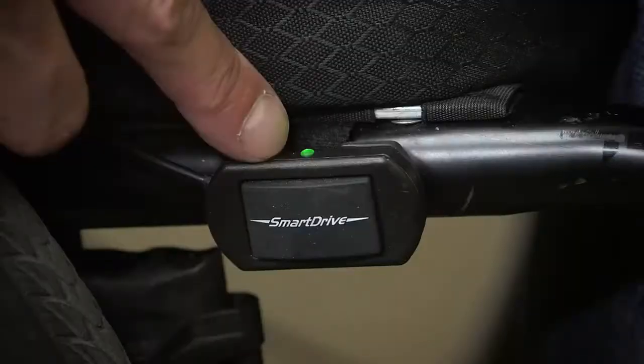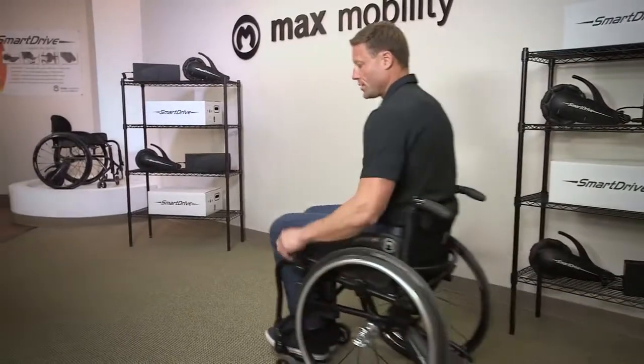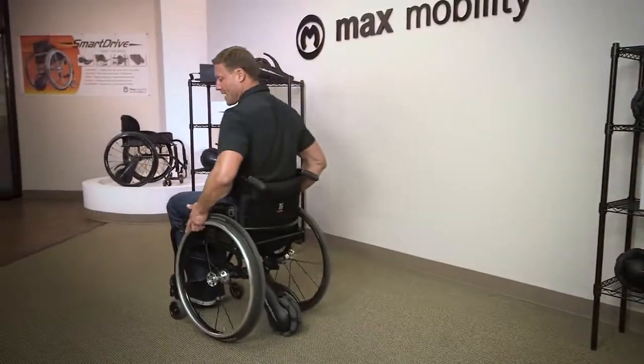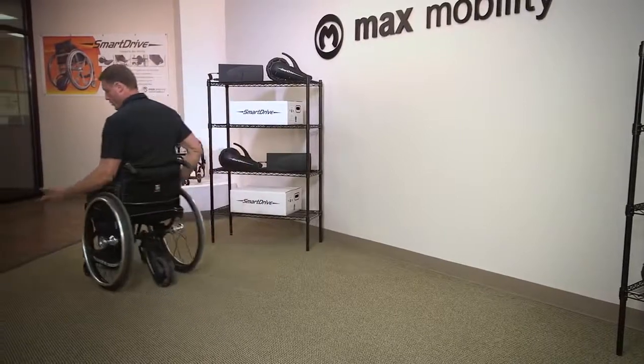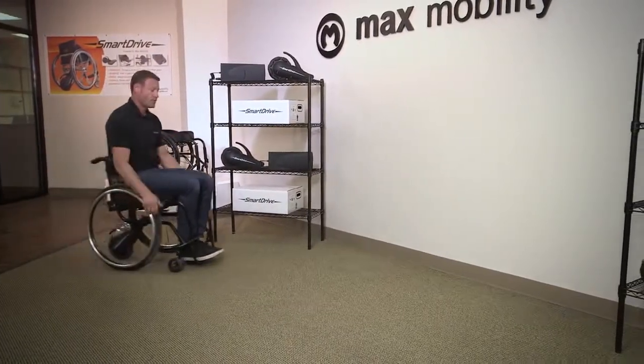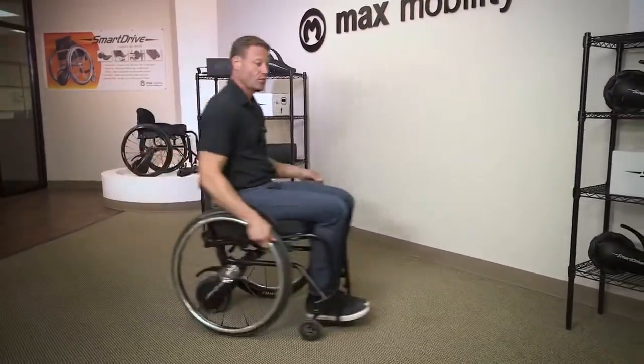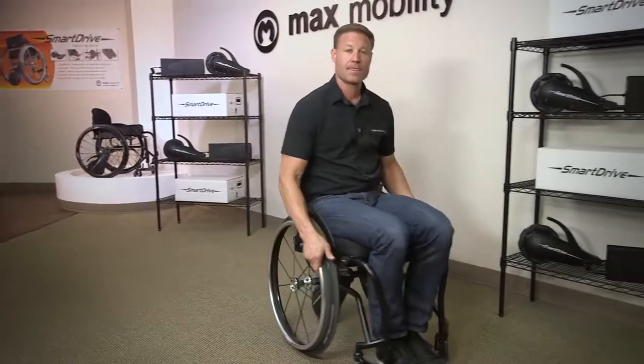So outdoor mode, blinking light, push to go, motor turns on. You cannot stop it by braking unless you press the button to turn off the motor. Again, it makes it very useful for being able to turn sharply and go on ramps without the motor turning off.